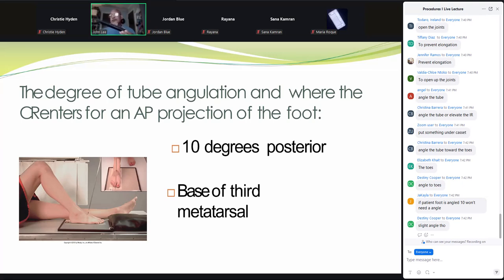That is true. But if you have a protractor so you can measure the angle of their foot, the easiest and best way to do this is to use the collimator housing on your tube. That bottom surface, that flat portion of the collimator housing, is always flat, right?